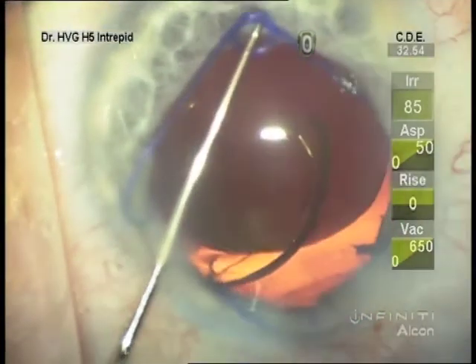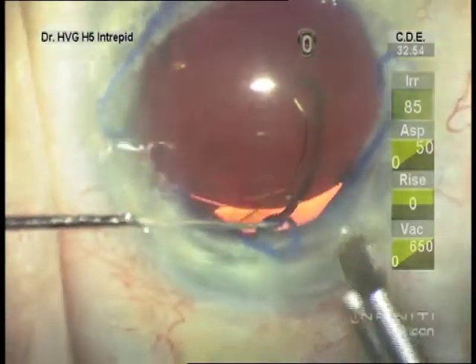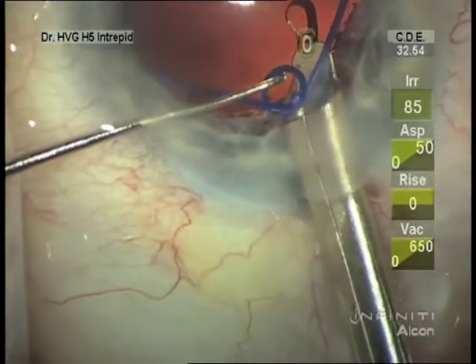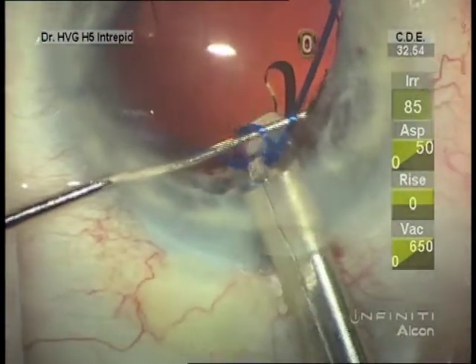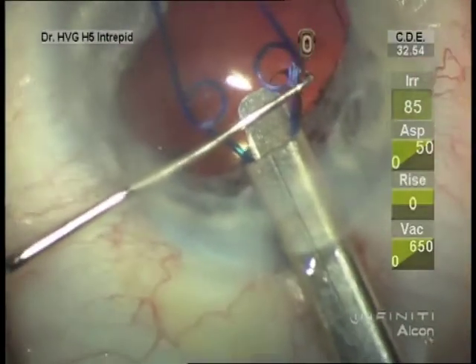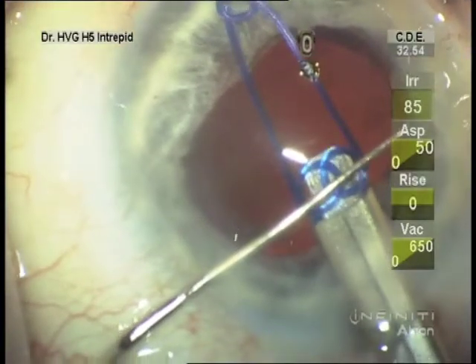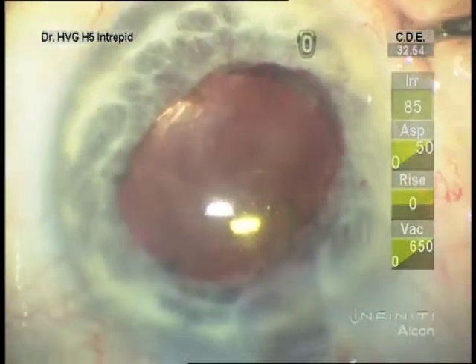Now removing it — I like to disengage the distal loop as well as the proximal loop. Get under the edge, a little to the side where the hook will go beside the loop, and then swing over and engage the loop. Pushing down on the Malyugin ring as the side loops come to the injector helps to get them into the injector, otherwise they'll often catch. We can use the injector to remove the loop without cutting it.